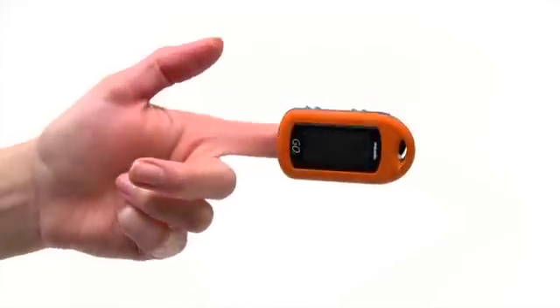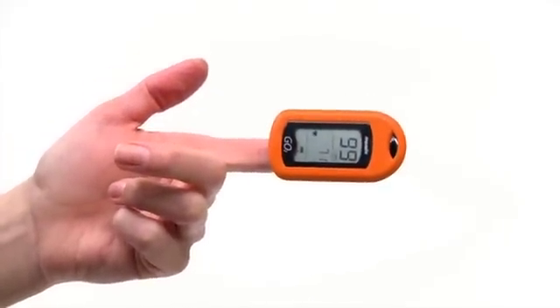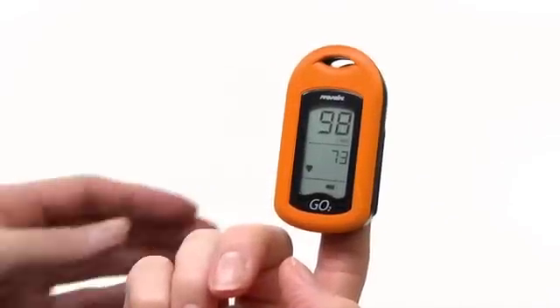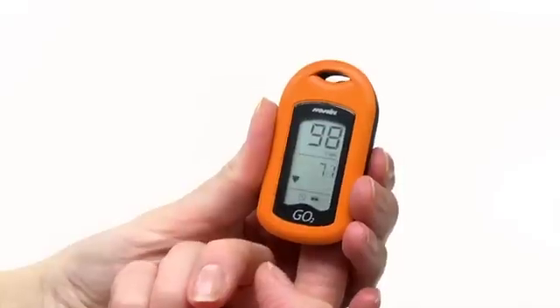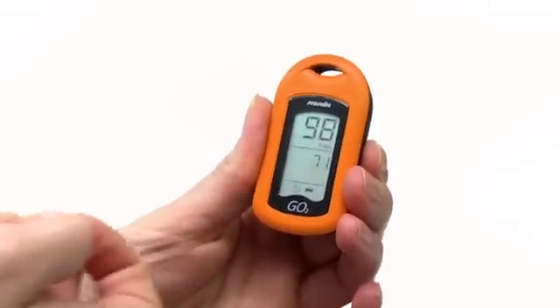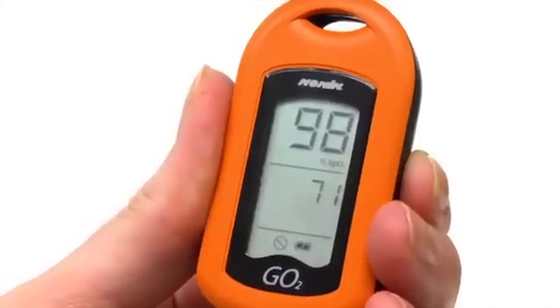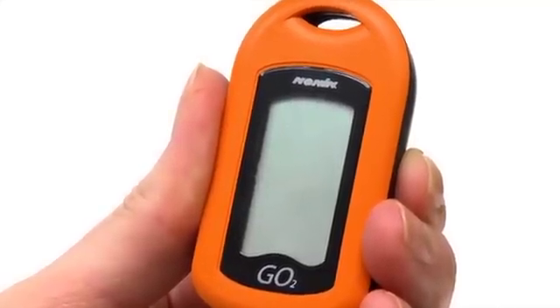Remember, proper placement is important for accurate readings. When you are ready to stop using the oximeter, simply remove it from your finger. You'll notice the sensor disconnect indicator appear. The GO II will turn itself off a few moments after it is removed from your finger.